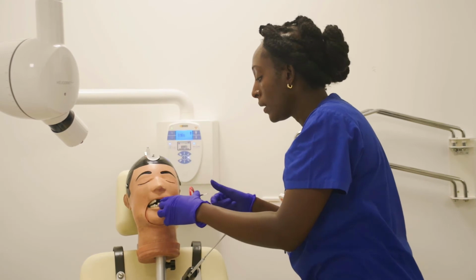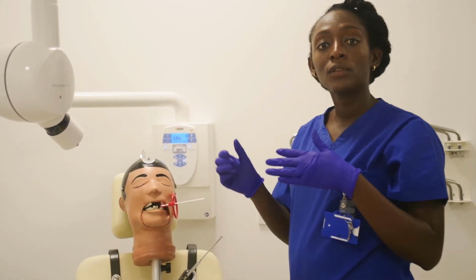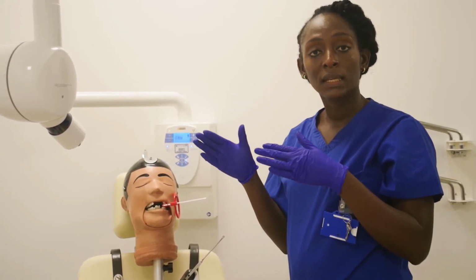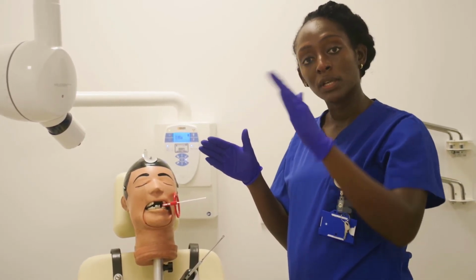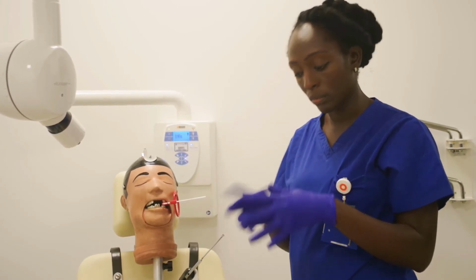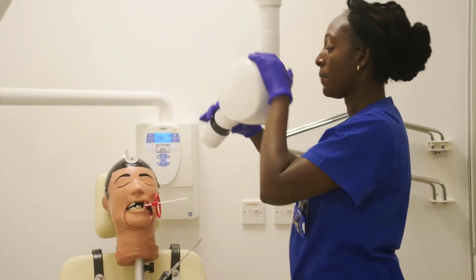Secure it in and then push it in. As Mark said, if you find that the patient has got no teeth in the region that you're taking, such that the holder is not able to lie parallel, you can support it with cotton wool roll, as he did with the anterior teeth. So I'm going to line it up again.